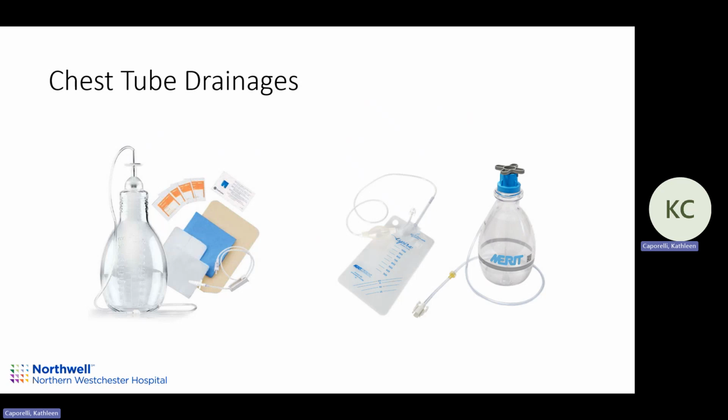There's usually a roller clamp that you can use to control the amount of drainage, and patients will let you know when to stop draining. Either it stops draining on its own, or they start having pain, discomfort. That's usually when they stop draining.